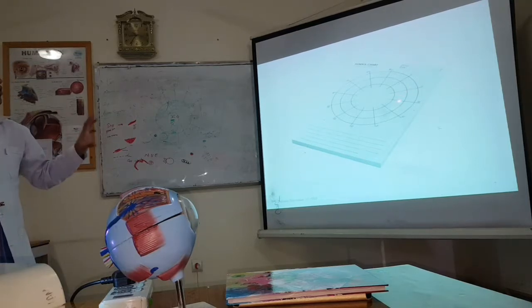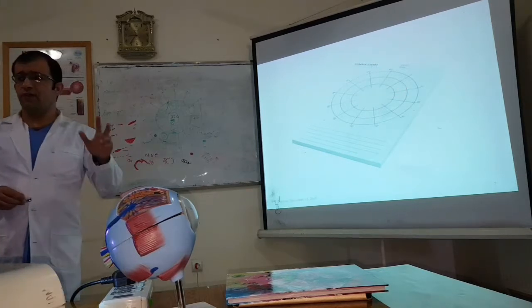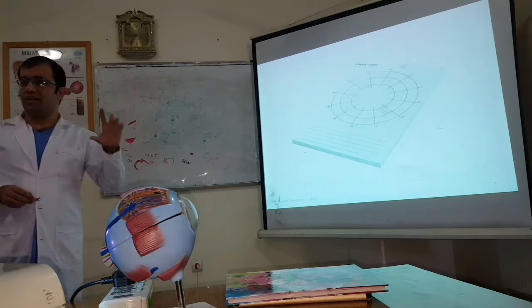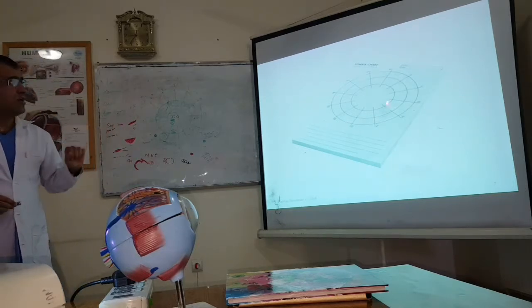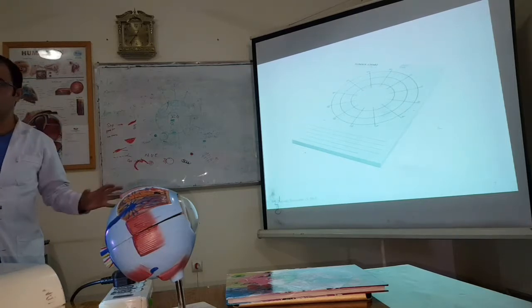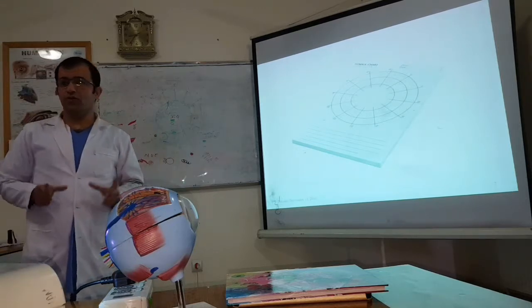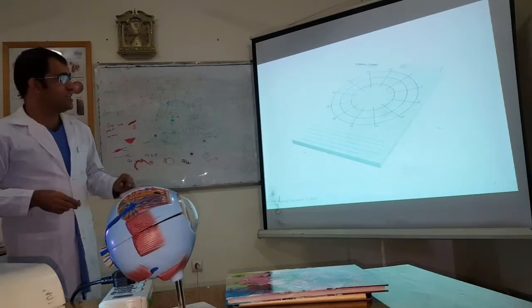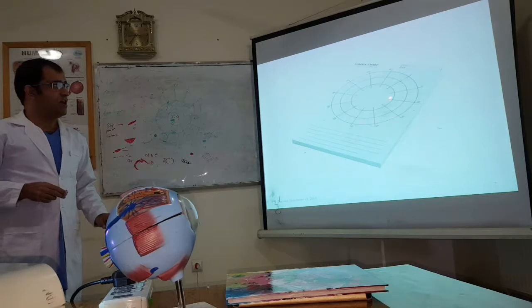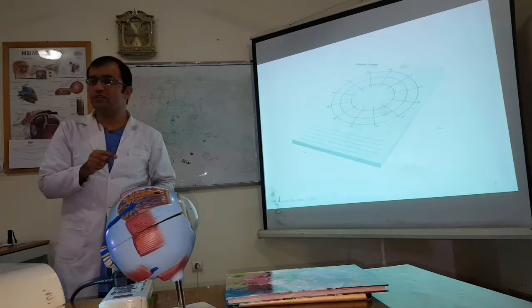And how to know the ora serrata? We can easily find it during funduscopy, because serrations are there, so we can understand. But how to know the equator? It's also a challenge for us. Do you know how to find the equator? Later on I'm going to talk about it. Because in the paper we have the equator, but how do we find it, for example, if there is a lesion posterior to the ora serrata? The equator is not drawn in the fundus. During funduscopy, you will not see the equator.